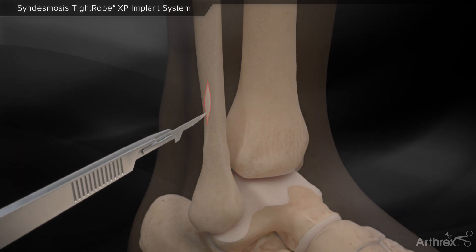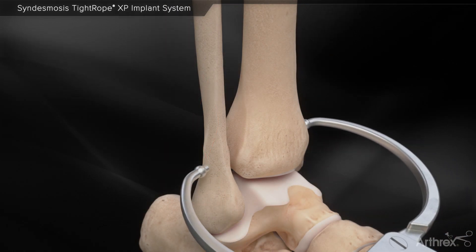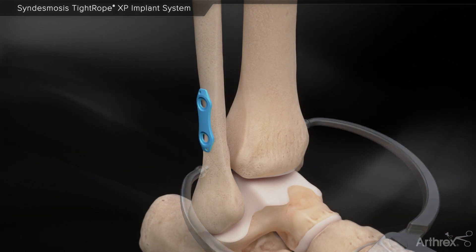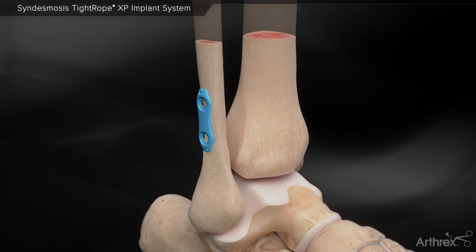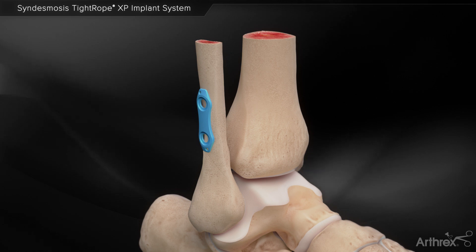A small incision is made along the lateral fibula. A syndesmosis clamp can be used for reduction. A low profile two hole syndesmosis plate is inserted along the lateral fibula. BB tacks can be inserted to hold the plate on bone.